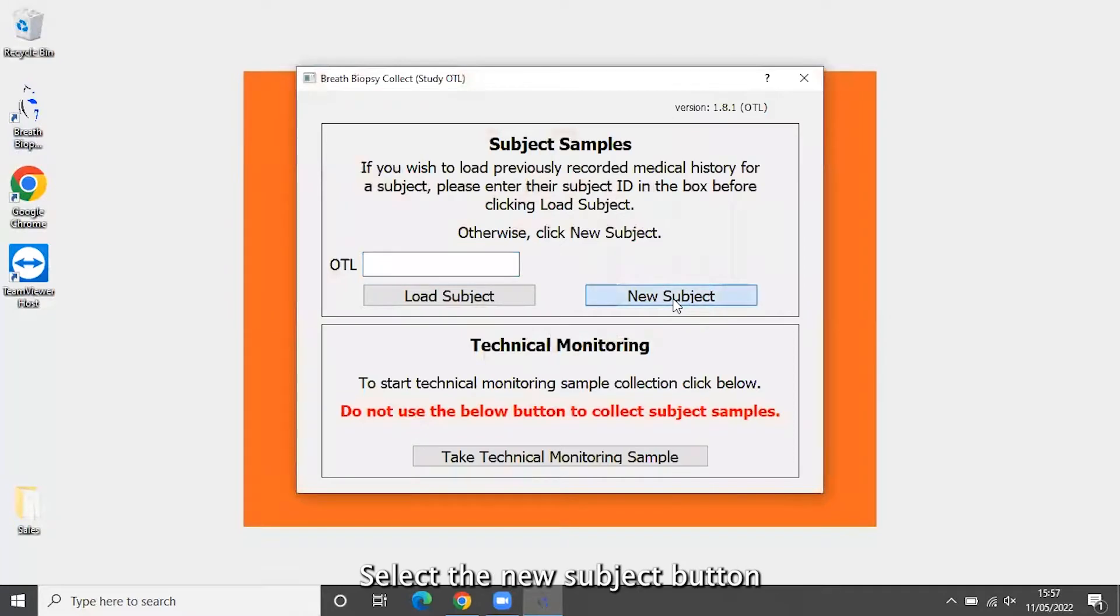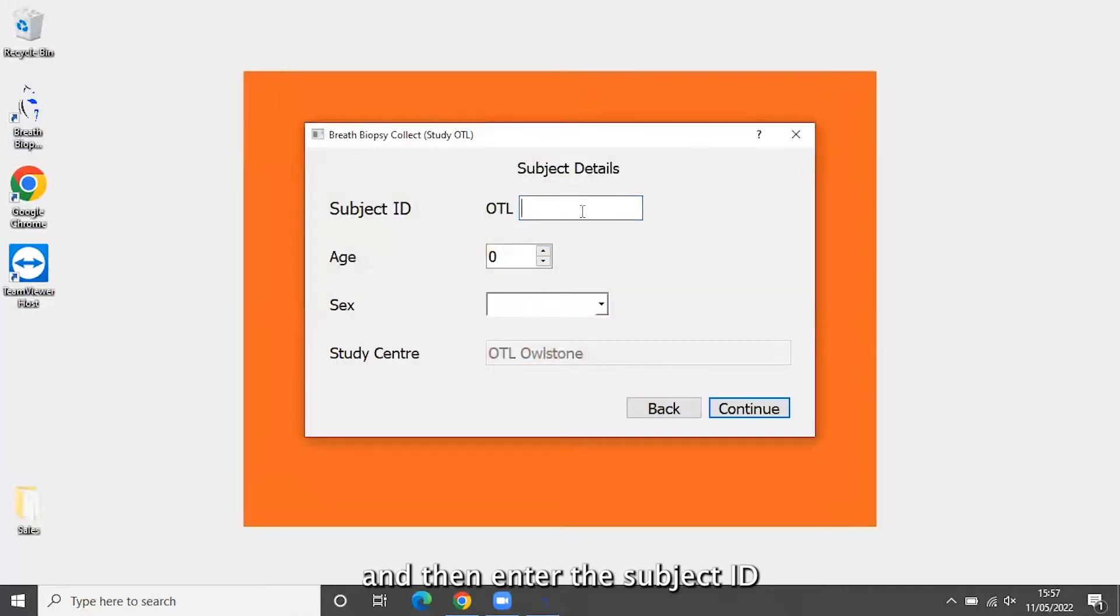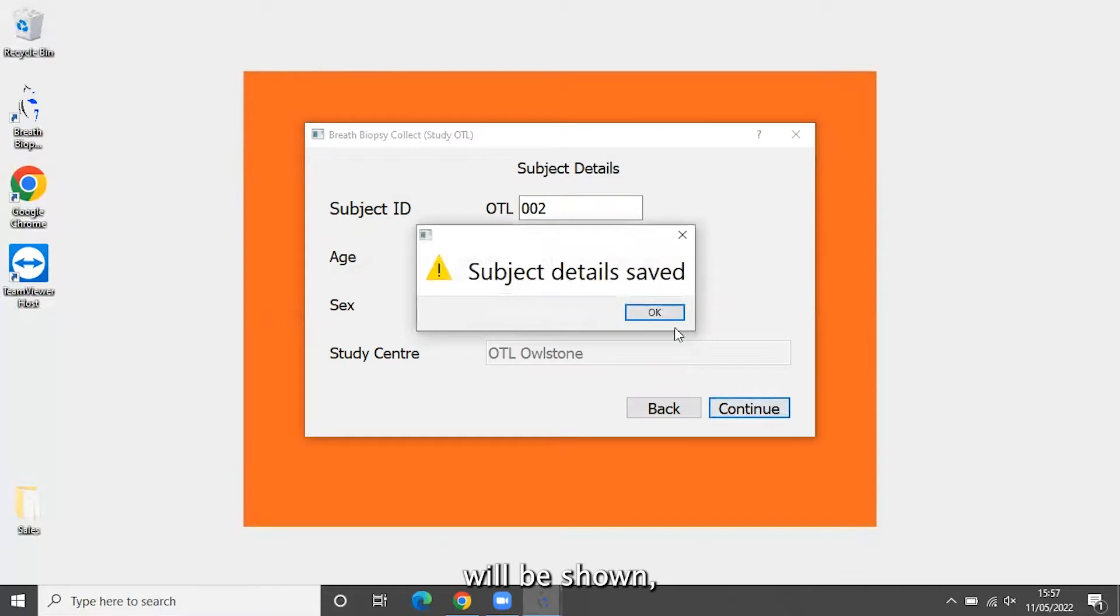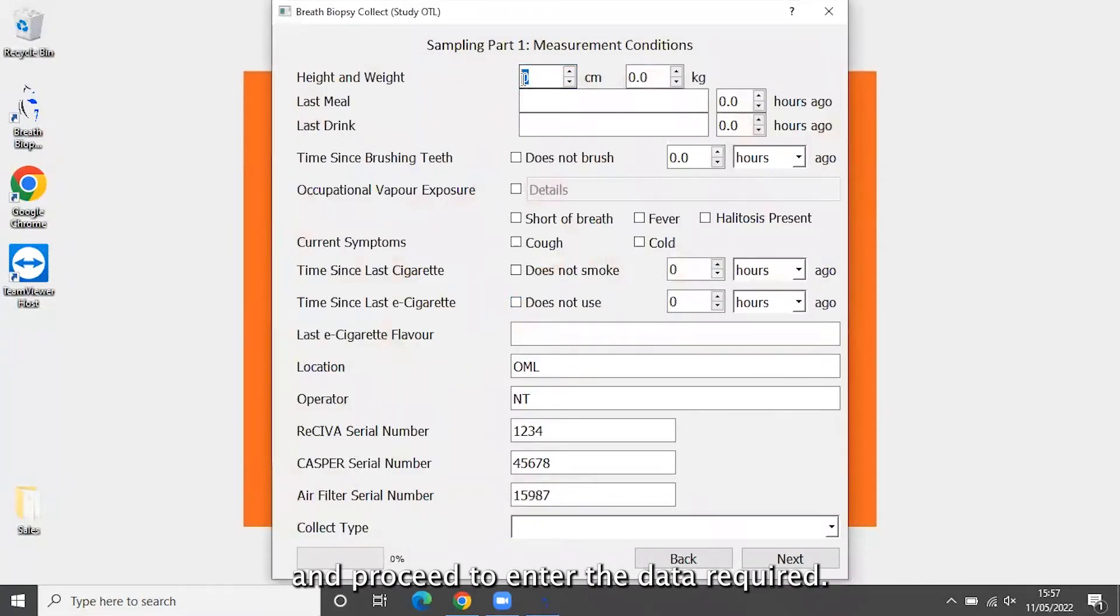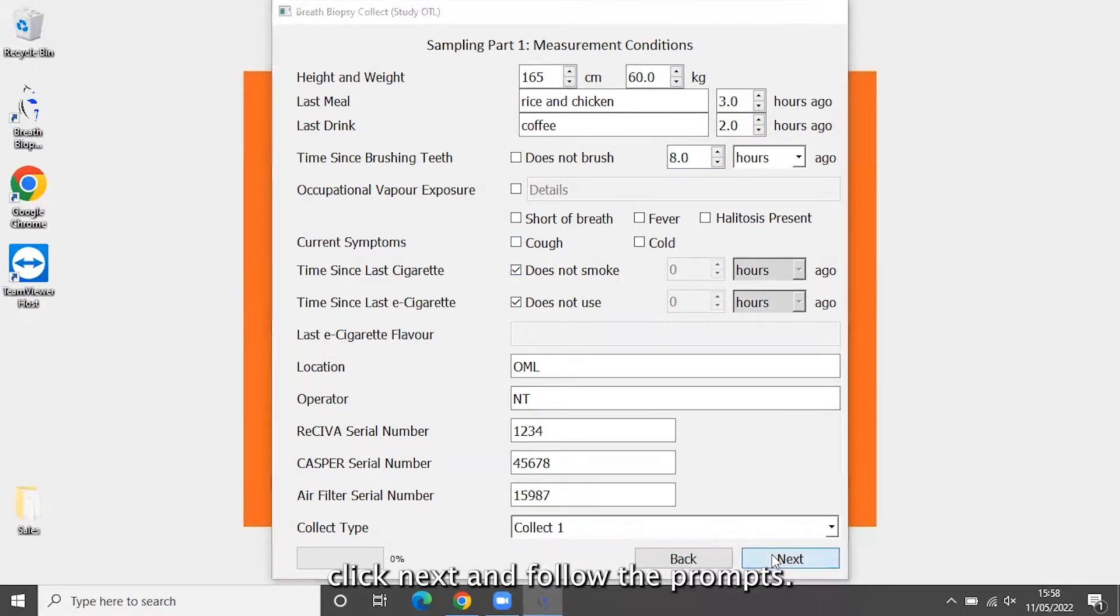Select the new subject button and then enter the subject ID and details to create the subject profile in the system. The home screen of the software will be shown. Select new sample and proceed to enter the data required. Once completed, click next and follow the prompts.